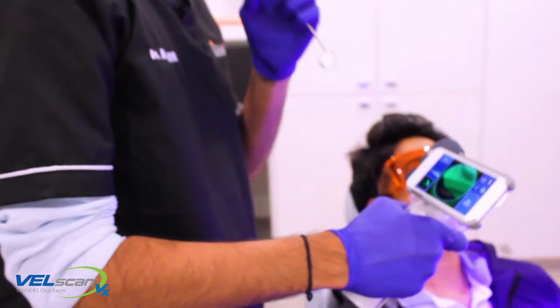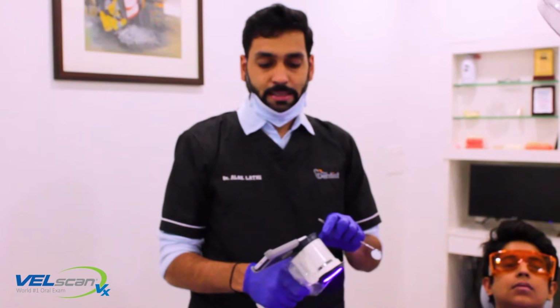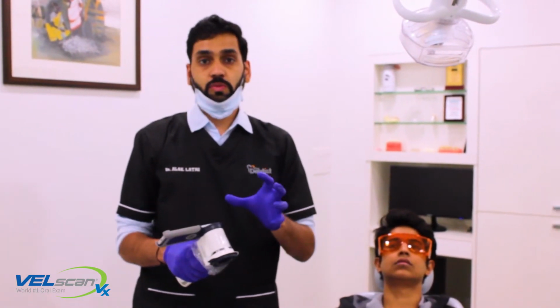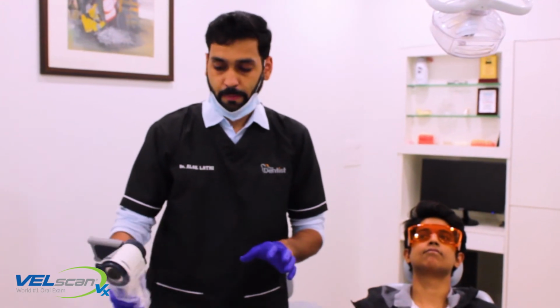So why do we need this device to be used along with the white light? The simple reason is, if under the epithelium some things are developing, which may take a few years to surface, they can be captured by the VELscope well in time. And that's how it's going to be important to keep our patients safe and help in diagnosis of lesions which are not seen to the naked eyes. So that is the usefulness of this device called VELscope. Thank you.